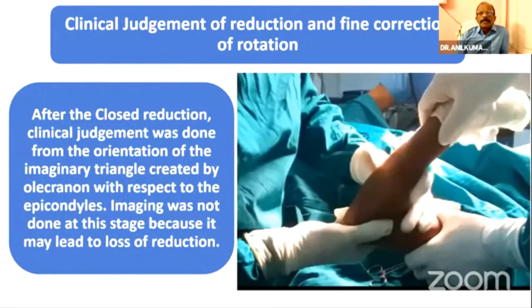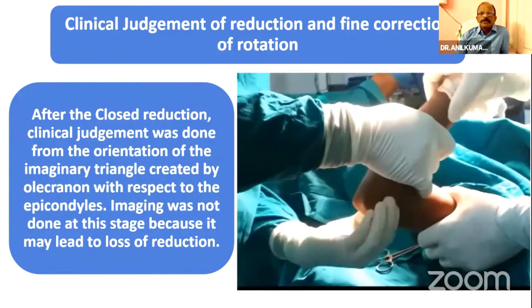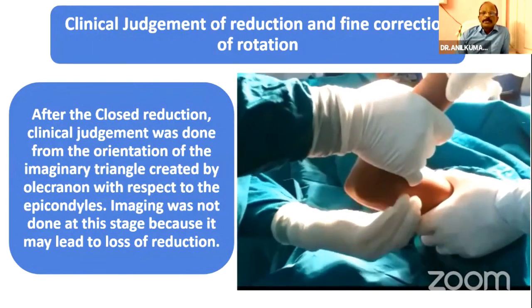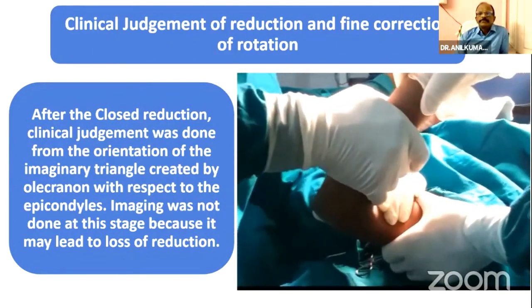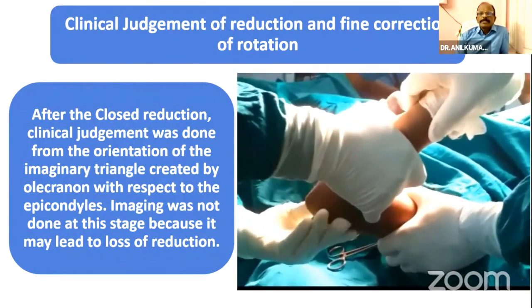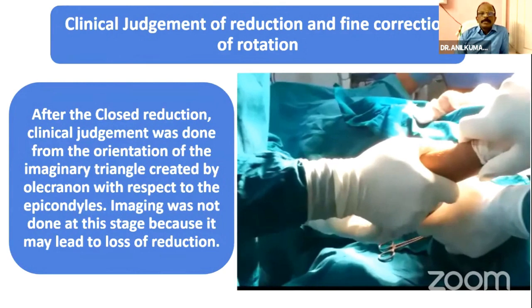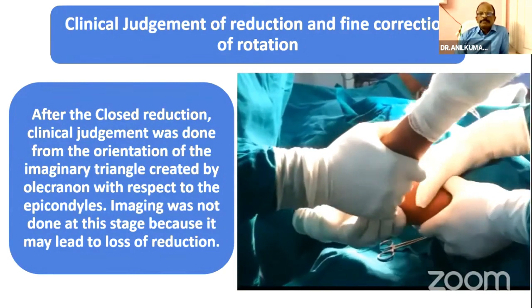After primary clinical judgment of the reduction is done by the orientation of the imaginary triangle created by the olecranon with respect to the epicondyles, imaging was not done at this stage because it may lead to loss of reduction. You can see this video for the rotation corrections. The fine correction can be done at this stage in the distracted position itself. That's the main advantage of this, and we can proceed to the pinning technique.